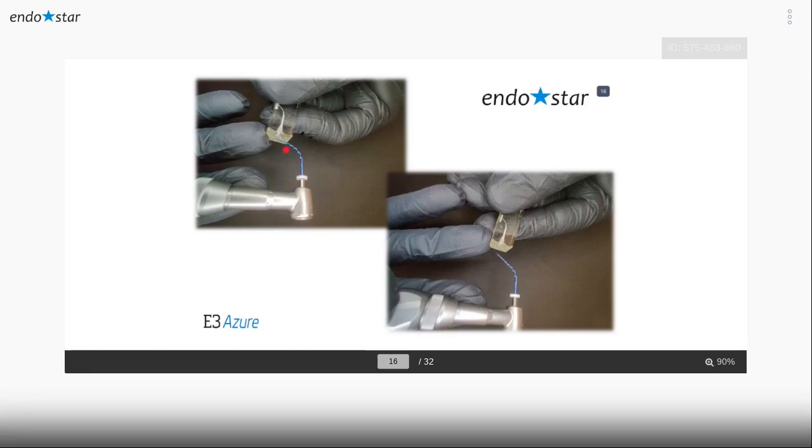I curved the file on the block, and when I remove the force, it keeps the shape. So this point has a lot of application in our practice. Some people say, no, I use it only to pre-curve the file. No, we will speak about it today. You will get a lot of benefits. I now use it in maybe 70% of my cases without any kind of manual files.